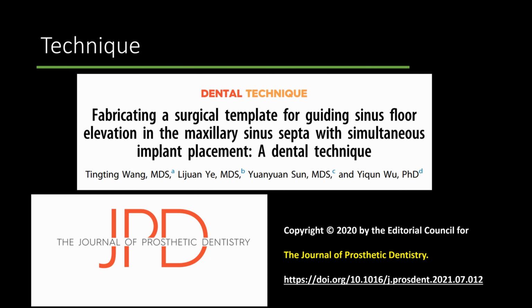This article describes a modified surgical guidance template combining implant placement and the sinus lateral window approach, developed for maxillary sinus septa that could impede dental implant surgery, which may reduce complications and surgical discomfort.